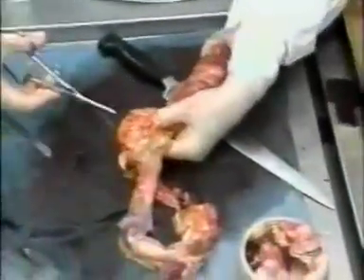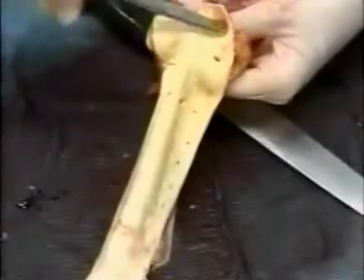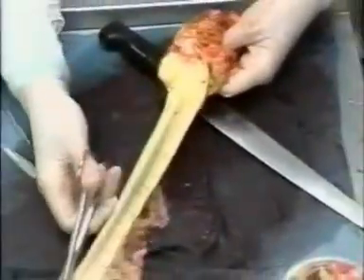Finally, she'll open the aorta. And you can see the openings for the branches of the costal arteries, the ones that run into your rib, coming off of the thoracic aorta.